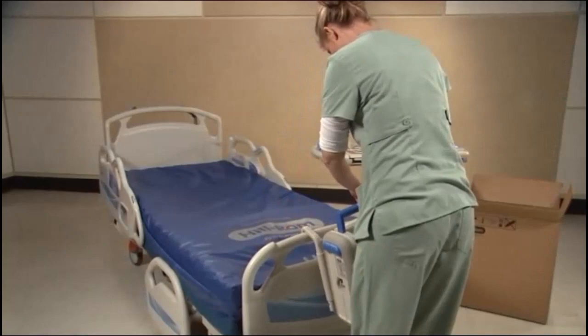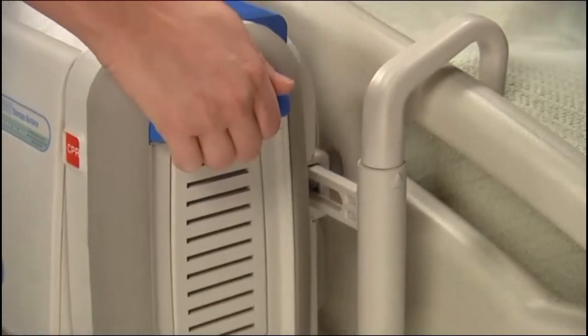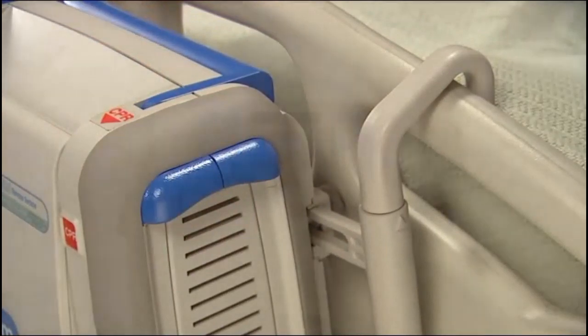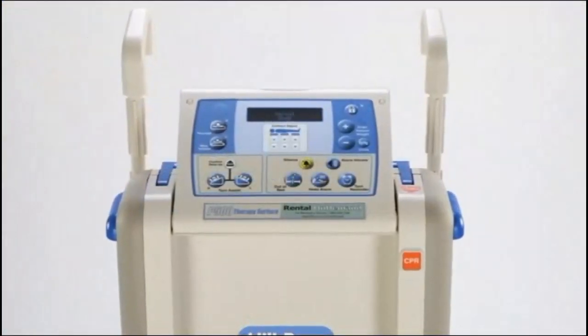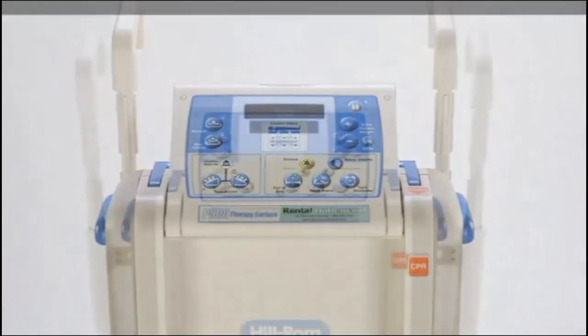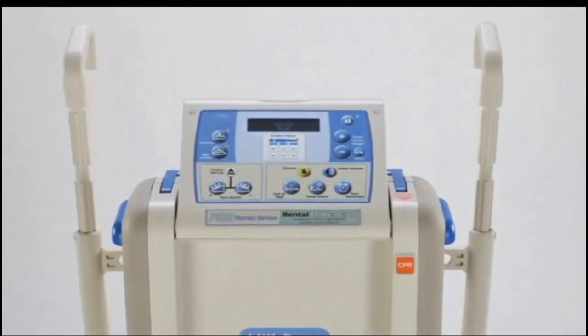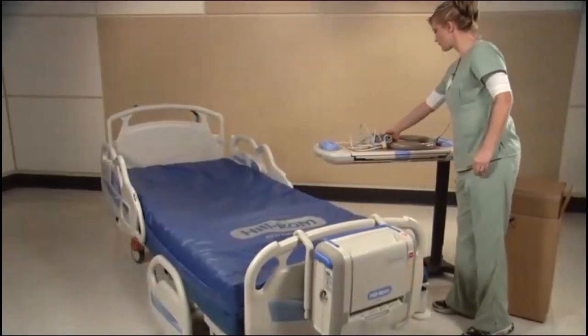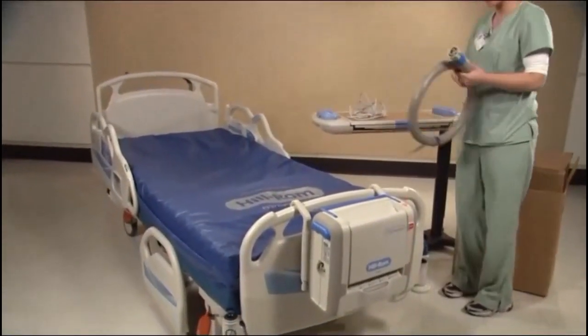Pull the hangers out from the unit to the applicable width. Turn the hanger hooks until the arrows on the brackets align. Adjust the height to the appropriate extension length. Turn the hangers approximately 90 degrees toward the bed to lock them into the correct position.